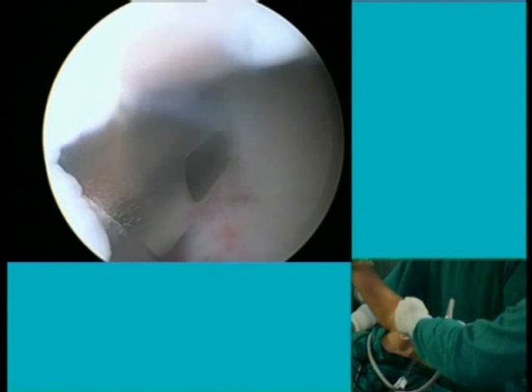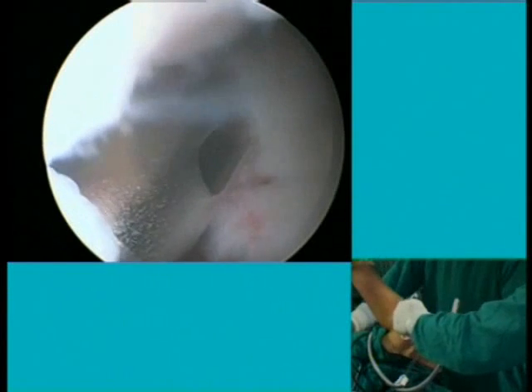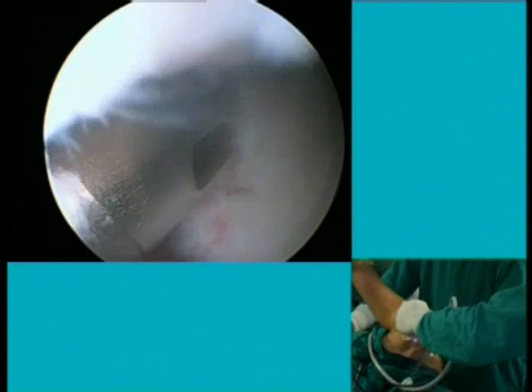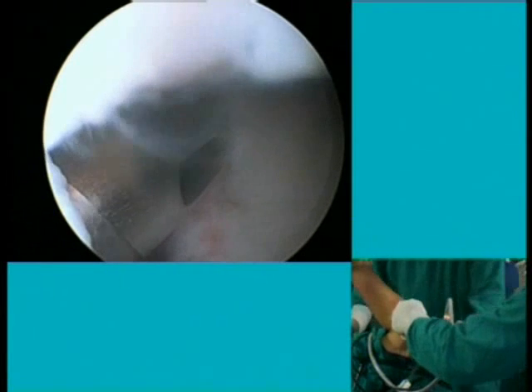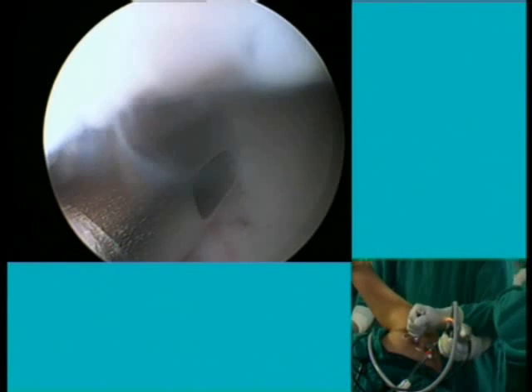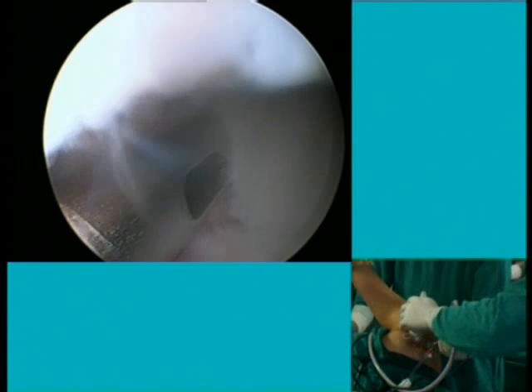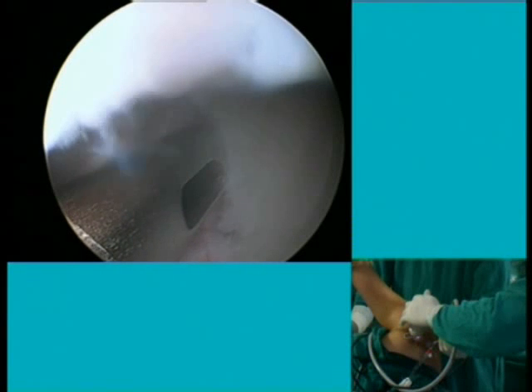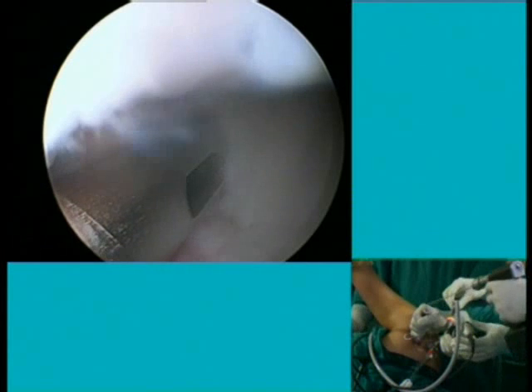I think we are almost ready with the drill now. Any questions from the audience? Please feel free to throw in questions in between if you want. Ready? Okay. Hold that down. Okay. I think I'm ready with the drill, and you don't have to drill too much. You just need to open the glenoid.